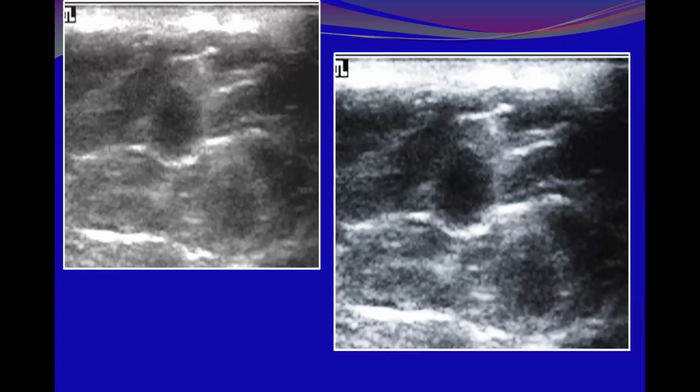Why is it only indistinct? It is indistinct and microlobulated. There is a faint echogenic rim. Okay, and the echogenic rim is non-uniform, the thickness of which at one point is thicker than the remainder. So that makes me unhappy.